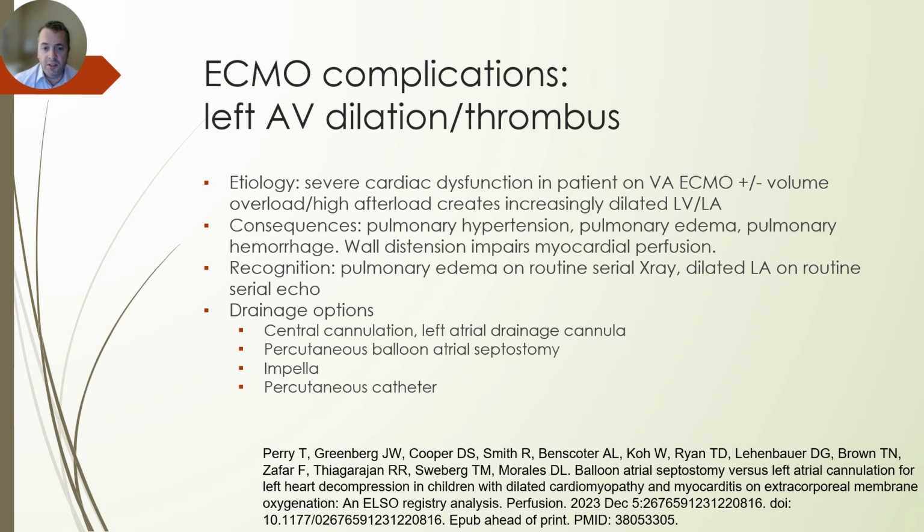If your x-rays are showing worsening pulmonary edema, or if you see a dilated left atrium on monitoring echocardiogram, if you're on VA ECMO, this can be a sign that you might need to perform a left atrial drainage procedure, and this can be done in several ways.